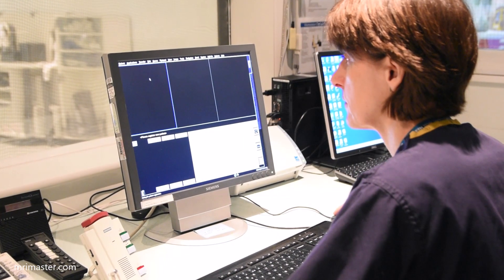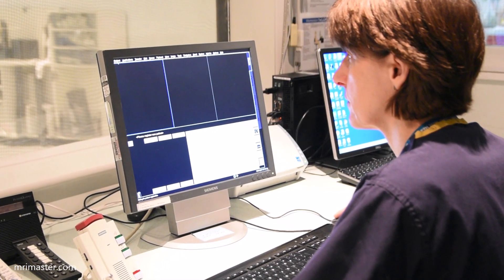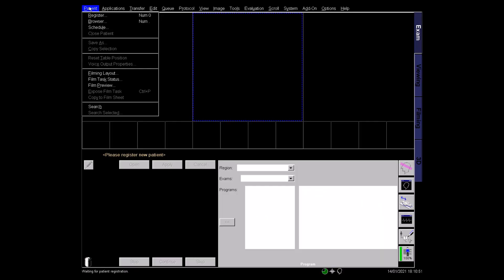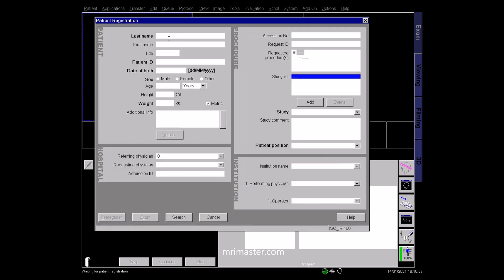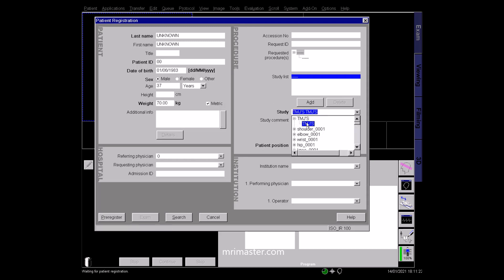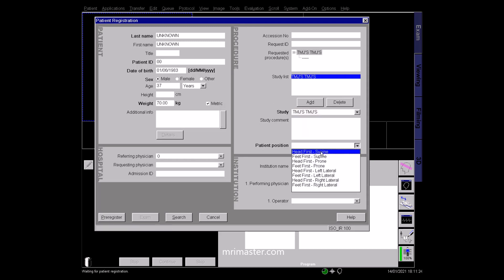Once in the control room, select the patient name in the browser or type in the details manually. Ensure all details including the patient weight are entered correctly so that the SAR levels can be calculated accurately. Register the patient as lying head first and supine.